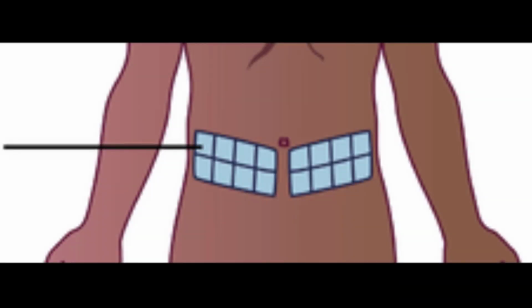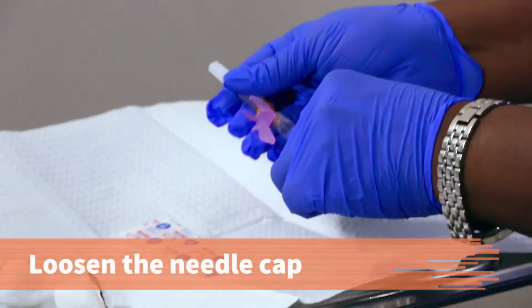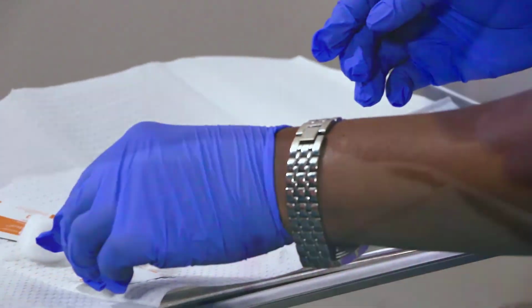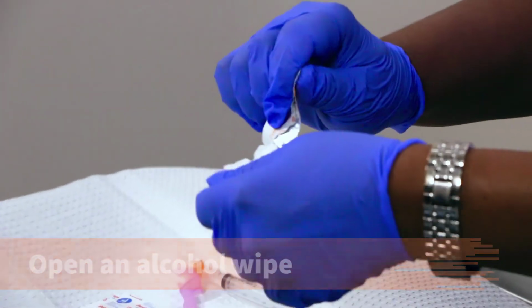To locate injection sites on the abdomen, draw an imaginary line below the lower ribs as far around as you can pinch up fatty tissue folds. Abdominal injections must avoid a 1-inch area around the navel. Loosen the cap on the needle so that you'll be able to open it with one hand once you clean the injection site. Open the alcohol wipe.